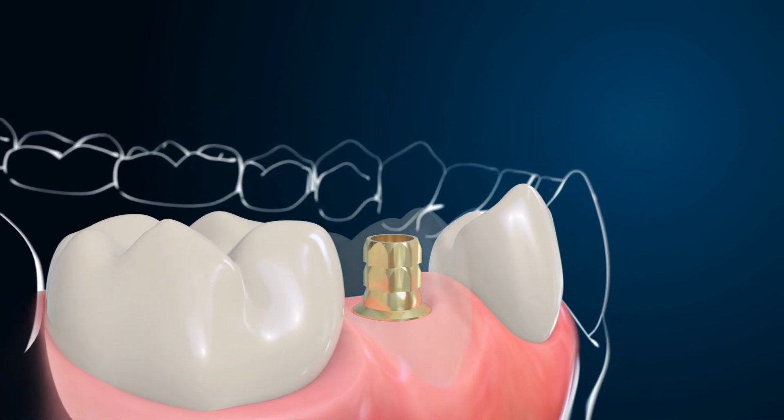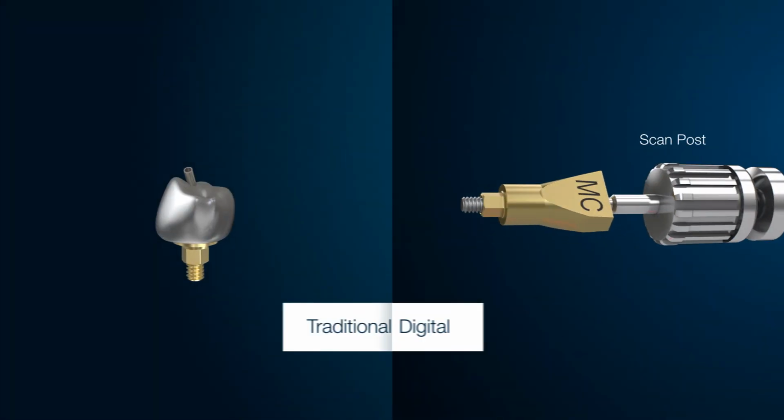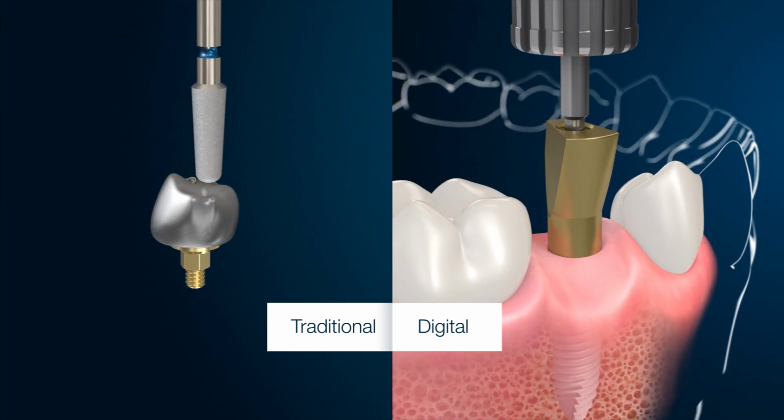Versatile in its ability to be incorporated into multiple or single restorations, the Connect may be used in traditional procedures or with CAD/CAM for both provisional and final prosthetic reconstruction.